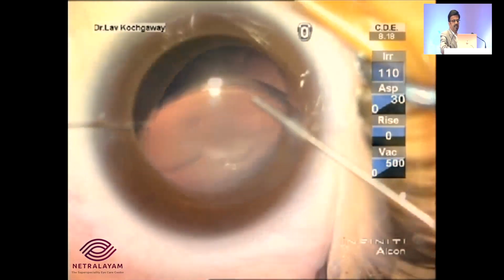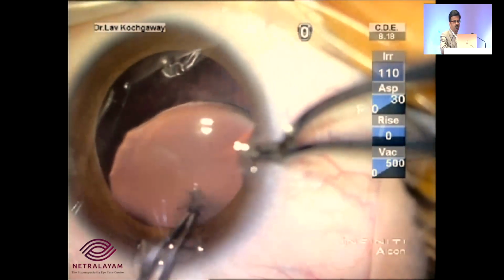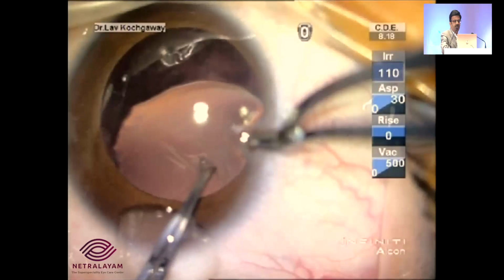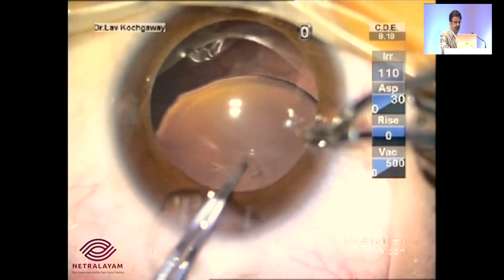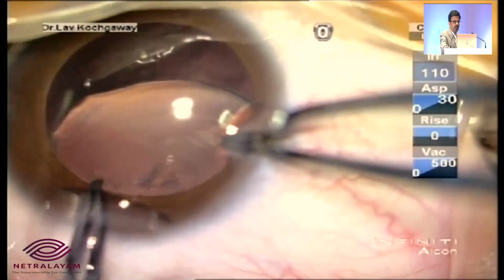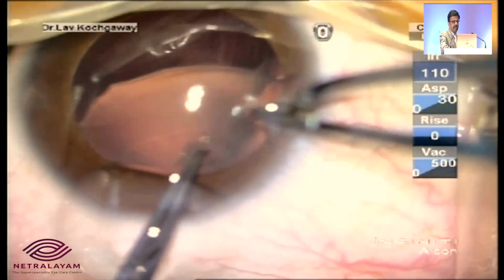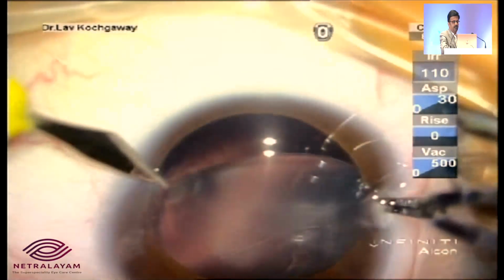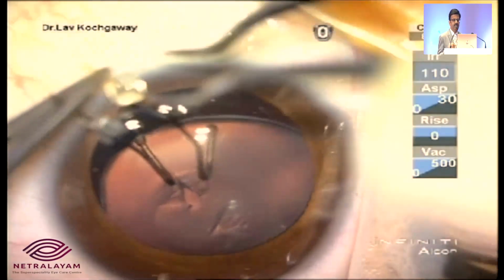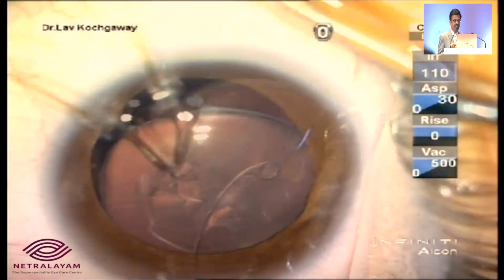When we present the first case, what you see here is that capsulorhexis is probably one of the most difficult steps in pediatric subluxations. With a mobile lens and the elastic anterior capsule, we have to put traction on the capsular bag so that we are able to complete the anterior capsulorhexis.